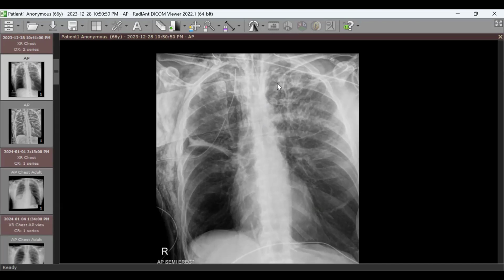My point is that if it is coming from the left side, you want to have it lower at the cavo-atrial junction and its tip directed inferiorly, because according to the anatomy, the catheter would be inclined to touch the lateral wall, because it's coming from the opposite side, and may lead to erosion and injury to the vessel wall. So we needed to go a little bit lower at the cavo-atrial junction, and we want it to be directed downward. That's my point.